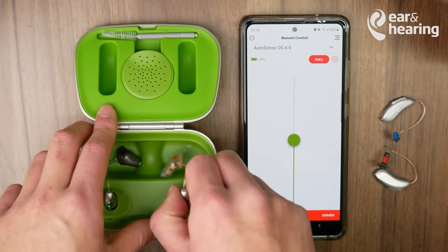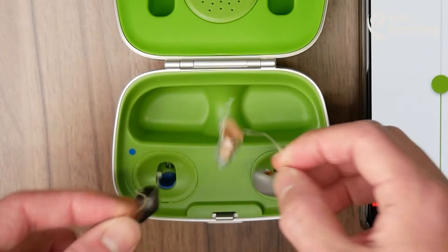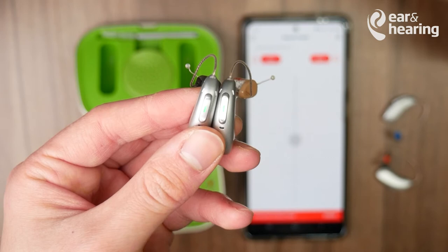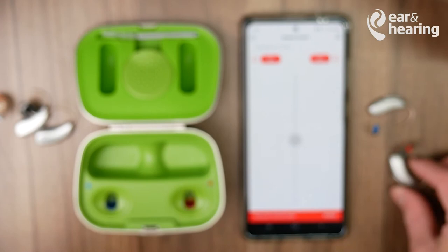The first thing we want to do with our hearing aids is restart them. If you already have them in your ears, put them inside the charging case, making sure that both lights turn green, and then pull them out — this way they will turn back on. This is for the rechargeable versions. If you have the traditional battery-operated hearing aids, just open the battery door and click them back in on both sides.